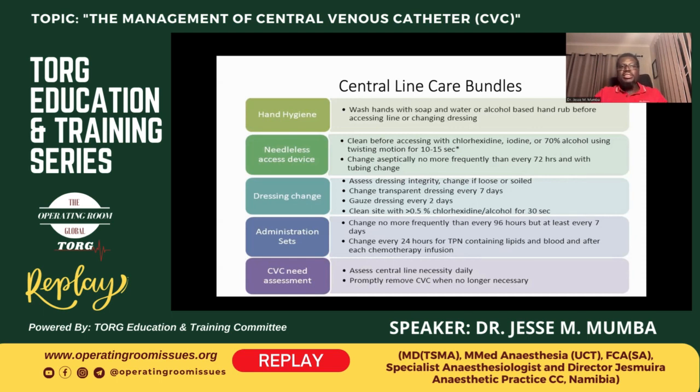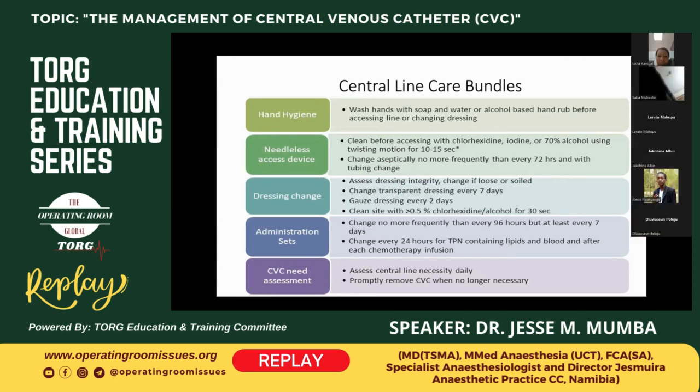Last but not the least, we need to make assessment of the central lines. The first question you need to ask is, does the patient still need the central line? If they've got a good peripheral line, there's nothing going through the central line anymore. For example, they were on adrenaline, which was stopped 2 days ago. Their condition that required them to be on an inotrope has resolved. You should ask yourself, does the patient need this central line?